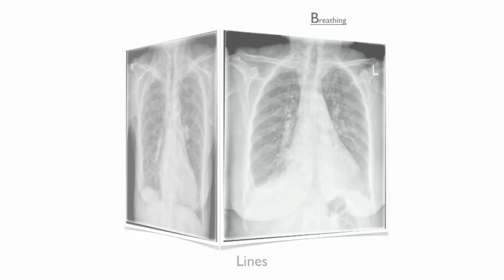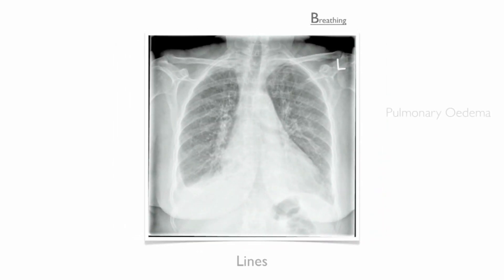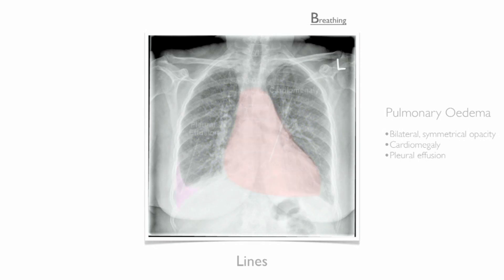The second presentation is pulmonary edema. Pulmonary edema presents as bilateral symmetrical opacity. There may also be cardiomegaly and pleural effusion present.